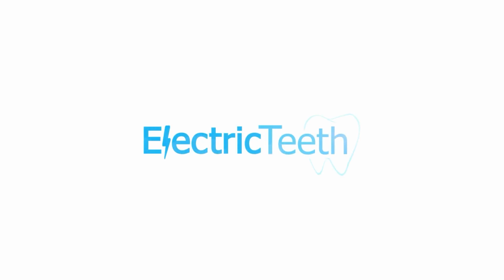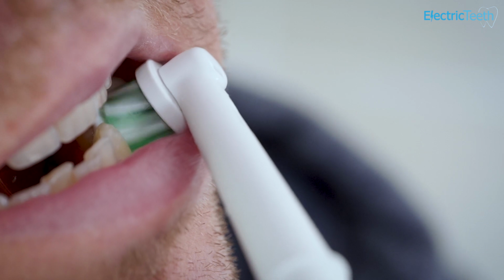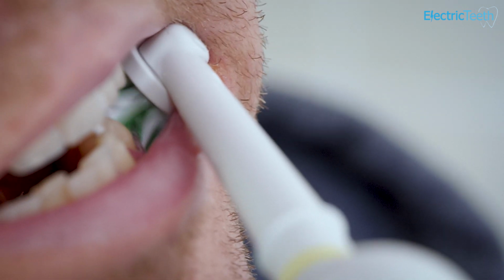So let me be clear, it's very rare that this problem is ever related to the toothbrush being faulty. The solution to this is actually very simple, but it's not necessarily the most obvious solution. Oral-B don't make the reason for these modes being locked very clear in most instances. You may have done it unintentionally. So it's unlikely you're going to need to send your toothbrush back for repair, but let me explain the ways you can go about fixing this.